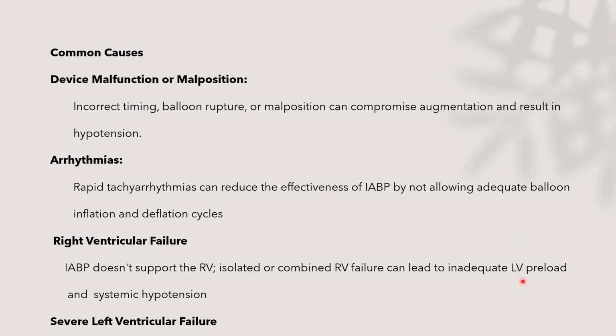For the intra-aortic balloon pump to work, there should be a pulse, with at least 1.5 cardiac index or stroke volume of 33. Less than that, the intra-aortic balloon pump cannot support cardiac output. The only support the balloon gives is 15%.